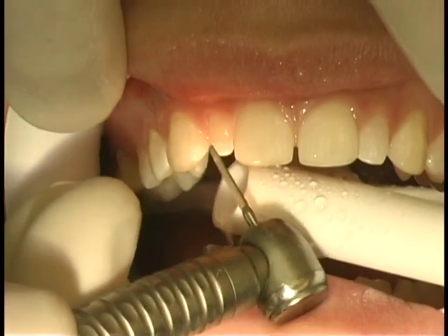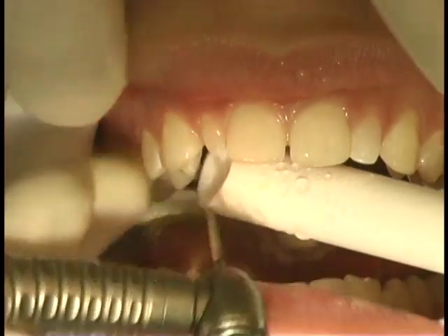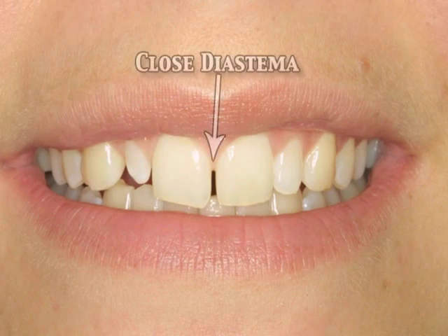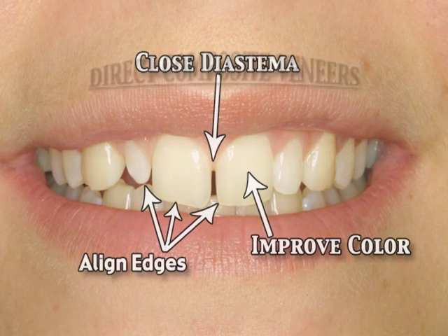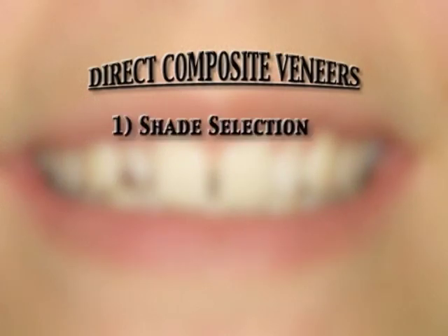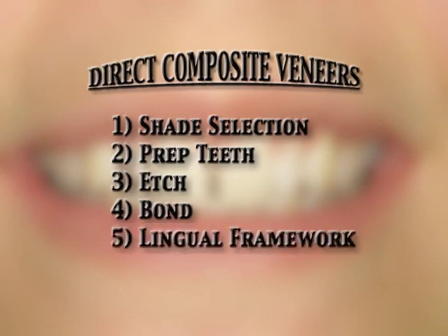It'll be very important throughout this procedure to not damage the soft tissue, as bleeding will bring this procedure to a halt. In order to close the diastema, align the edges, and improve the color, our steps will be: Step 1. Determine the proper shade selection. Step 2. Prep teeth for composite veneers. Step 3. Etch. Step 4. Bond. Step 5. Apply lingual framework using a silicone stent.